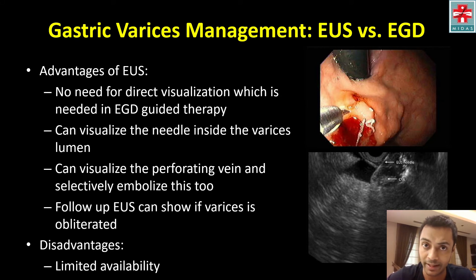You don't need to actually visualize the varices directly, which can be a problem if there's a lot of blood in the gastric lumen. You can visualize the needle inside the varices, and you can also sometimes identify the perforating vein, which can then be selectively embolized. Follow-up endosonography can confirm if the varices are obliterated — as in this case, where there was thrombus formation with significant reduction in blood flow. The disadvantage is limited availability of endosonography and the required expertise.